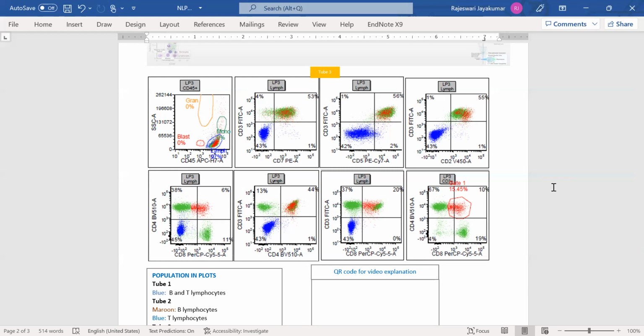Somehow the core biopsy was so tiny that it missed the neoplastic cells of nodular lymphocyte predominant Hodgkin lymphoma, NLPHL. So we noted this in flow cytometry and we raised the suspicion for either PTGC or NLPHL. And we said, this is not specific, but this is known to be seen in these conditions. So do a rebiopsy. When they did an excision, we saw nodular NLPHL in the lymph node of this patient. So this is just to bring your attention to some subtle findings that may be very helpful in practice.